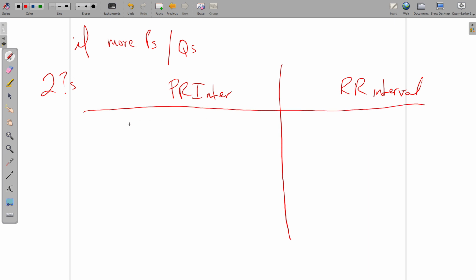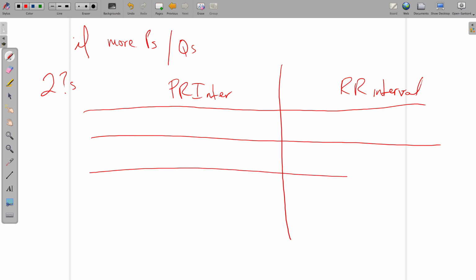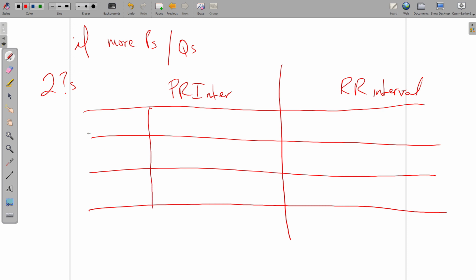So let's take a look at these different guys here, and let's talk about the level of dysfunction that's taking place. You can draw yourself this little chart, and this little chart's always going to give you the answer. All right, so let's put second-degree type 1 heart block, second-degree type 2 heart block, third-degree heart block. Now this chart you have to commit to memory.